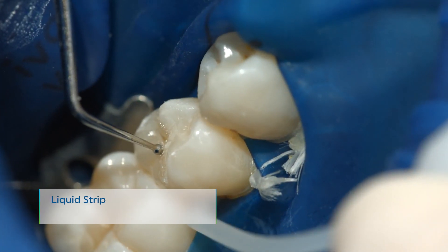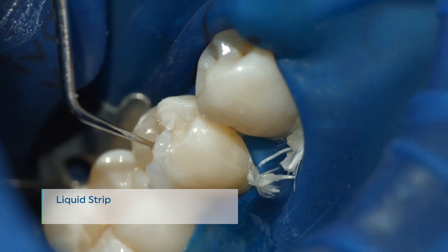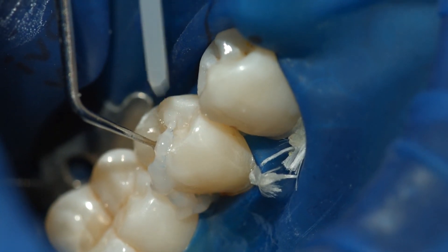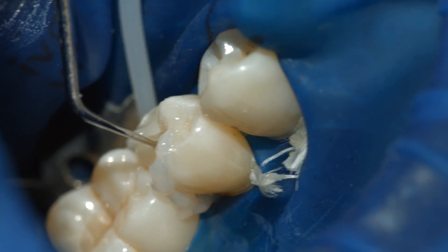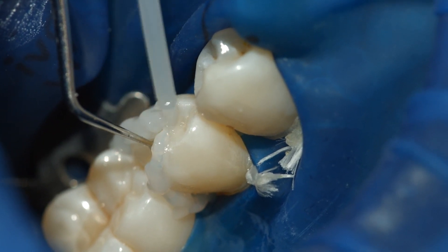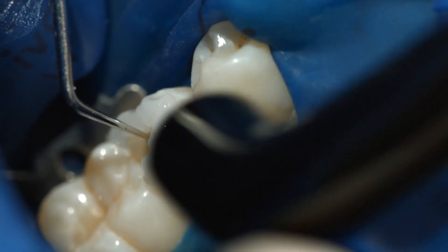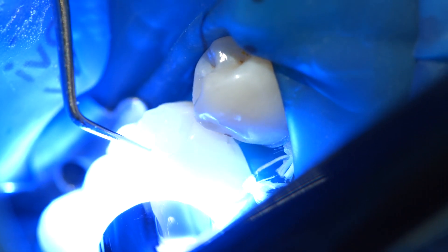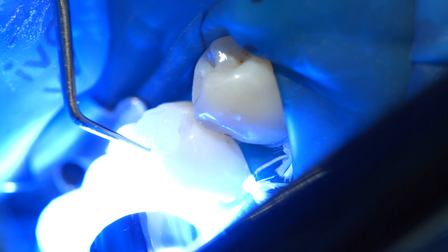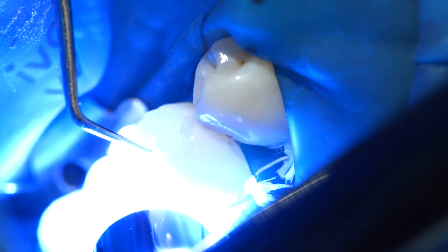Like all other composite resins, Variolink Aesthetic DC is subject to oxygen inhibition. To counteract this effect, cover the restoration margins with glycerin gel or air block immediately after having removed the excess cement. Liquid Strip is an ideal product for this purpose. Light cure all cement lines again for 10 seconds per segment and per mm ceramic, using for example blue phase style at a light intensity of 1100 mW per square centimeter.